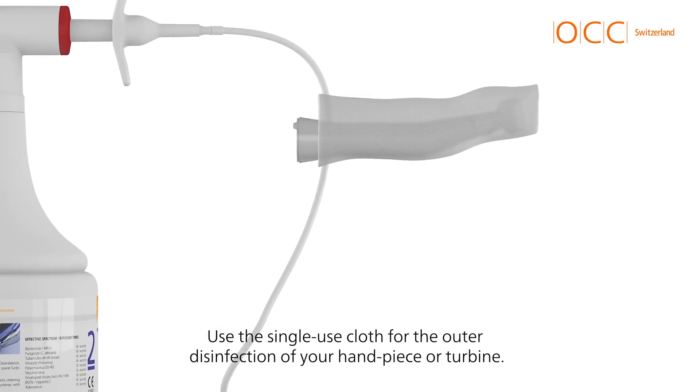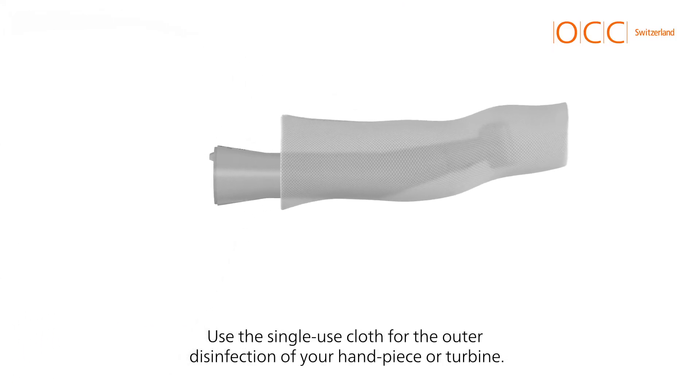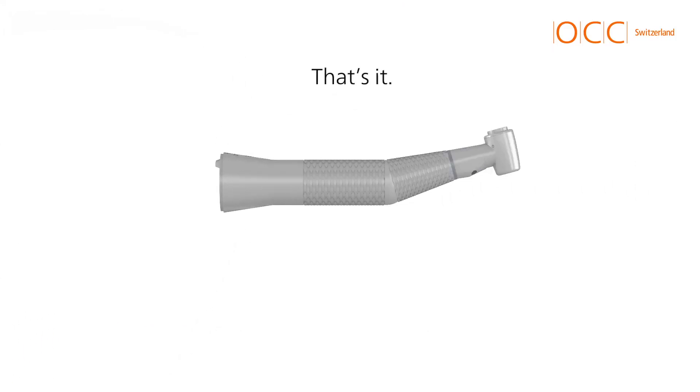Use the single-use cloth for the outer disinfection of your handpiece or turbine. That's it, you're done.